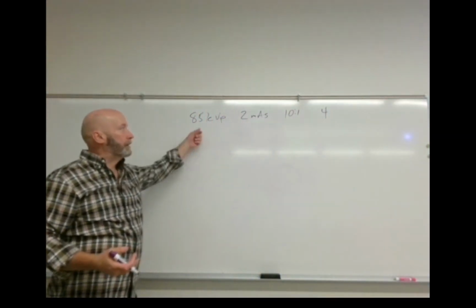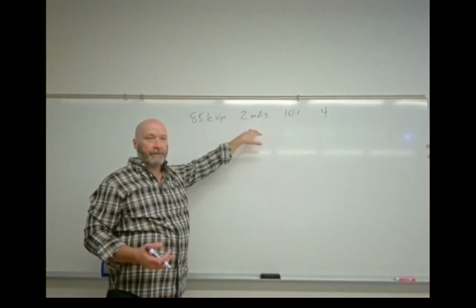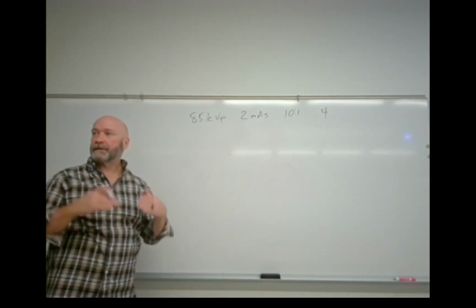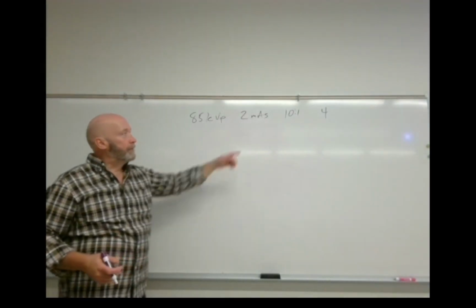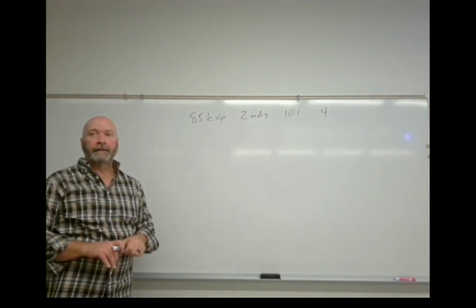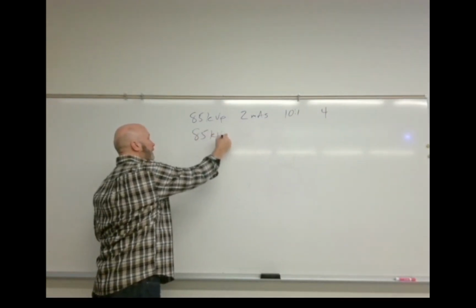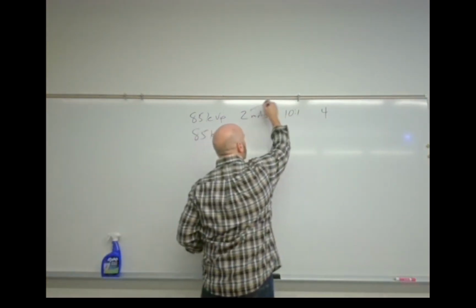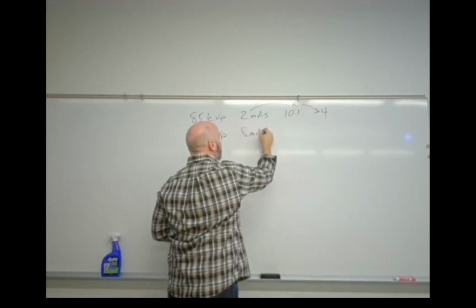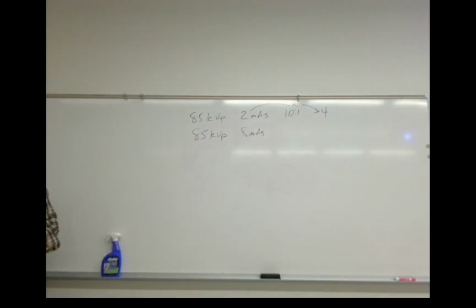So you shot the perfect x-ray. The only problem is you had so much scatter radiation coming off that pleural effusion that they couldn't see the air fluid levels well. So they said, okay, go back and do it again with a grid. So you added a 10-to-1 grid with a Bucky factor of 4. What is your new technique? 85 kVp at 8 mAs? Exactly. So it'd just be that times that would be 8 mAs, and it should give you the same exposure. So your index number shouldn't change between those two.